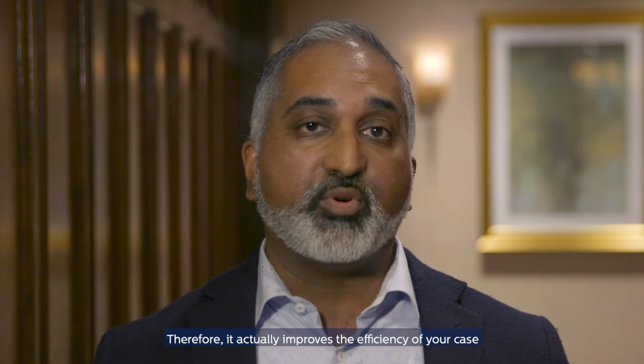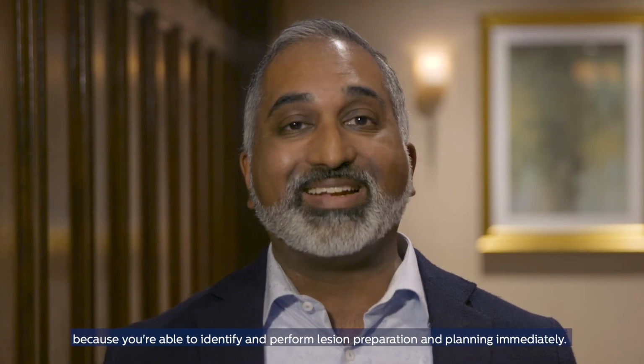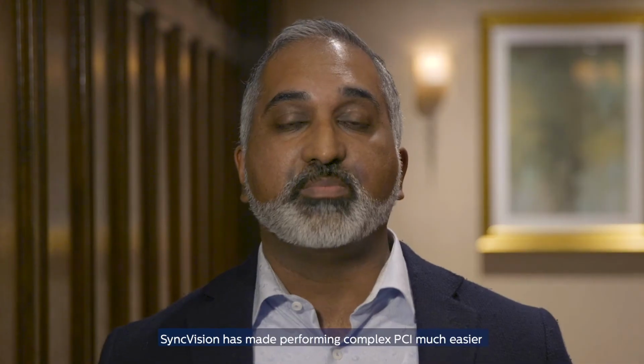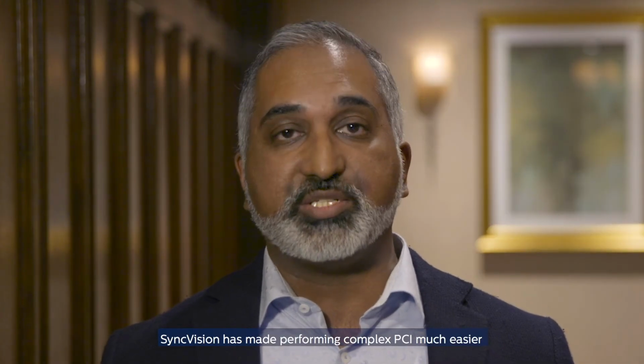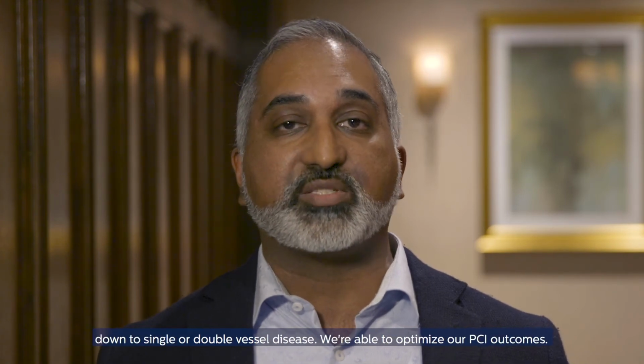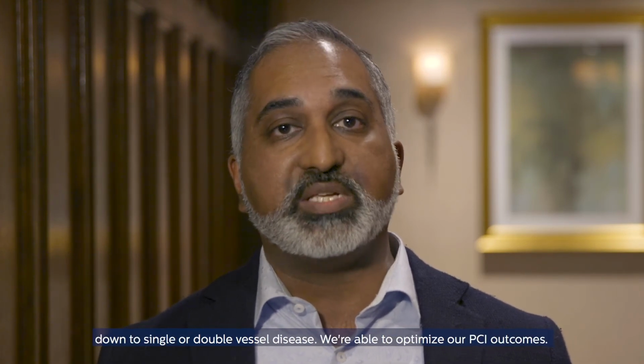Therefore, it actually improves the efficiency of your case because you're able to identify and perform lesion preparation and planning immediately. SyncVision has made performing complex PCI much easier. By simplifying patients from multi-vessel disease down to single or double vessel disease, we're able to optimize our PCI outcomes.